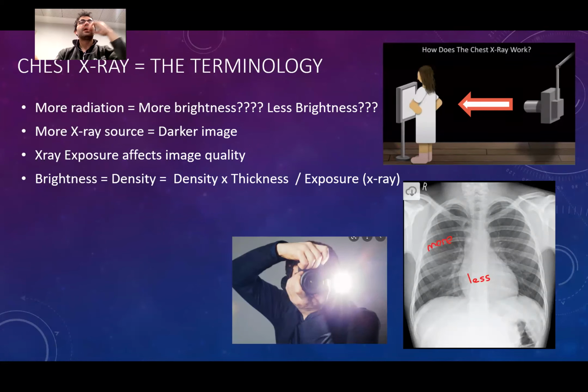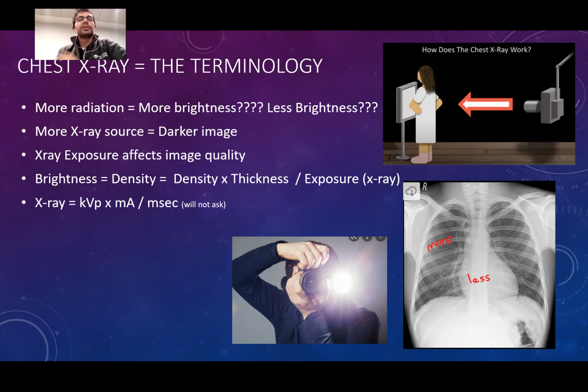It's a part of our technical evaluation. So the density, I mean the brightness of the images, is affected by the density of tissue, the thickness, and also the exposure. There are some dosing schemes here. I'm not going to ask them anyway.